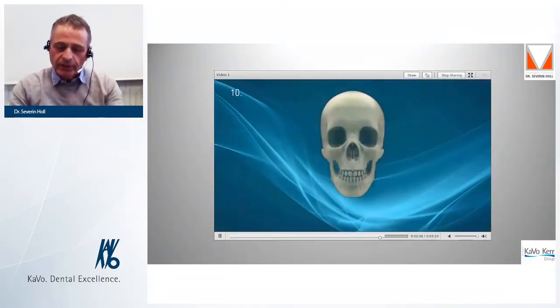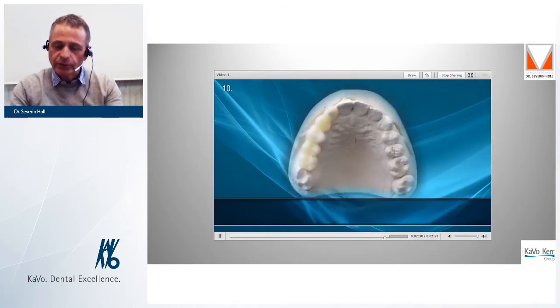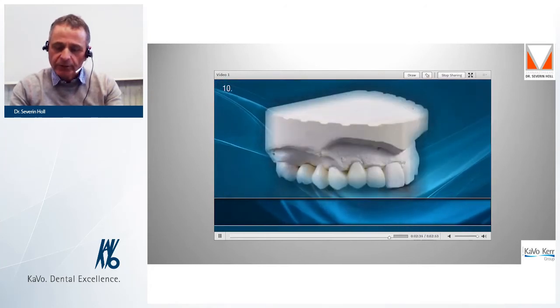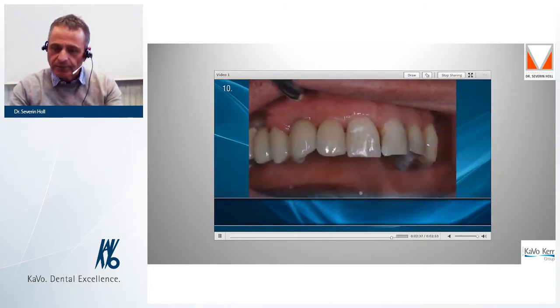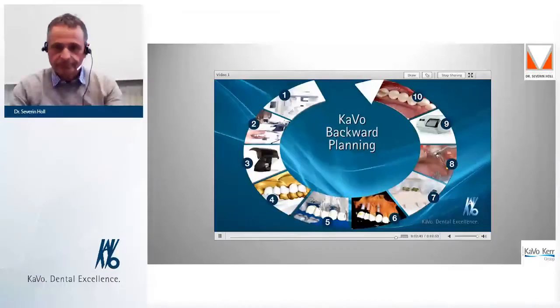In summary, we can say that if you use the digital workflow of the prosthetic treatment of our patients, we can reach a predictable and safe result. And today, it's basically possible.